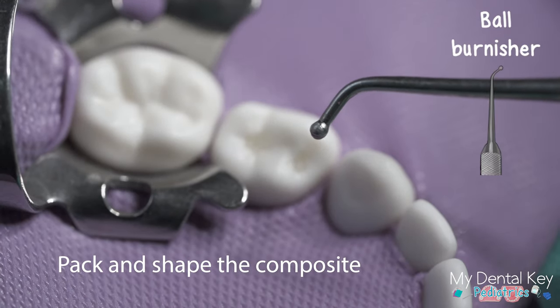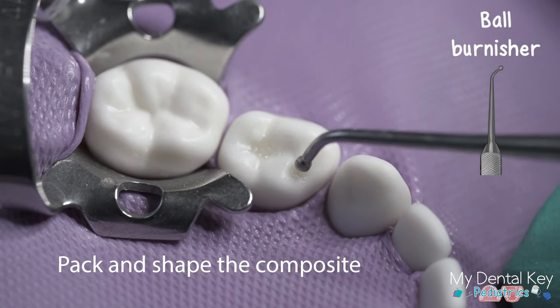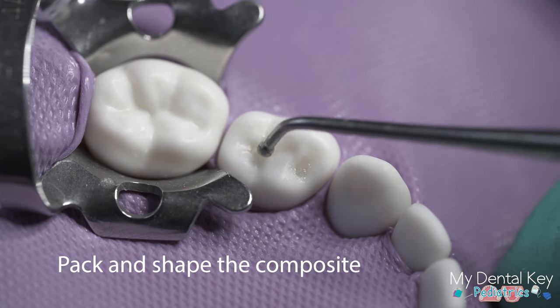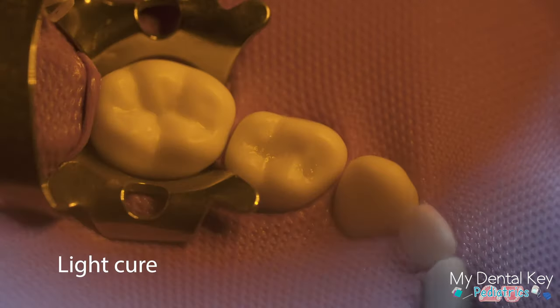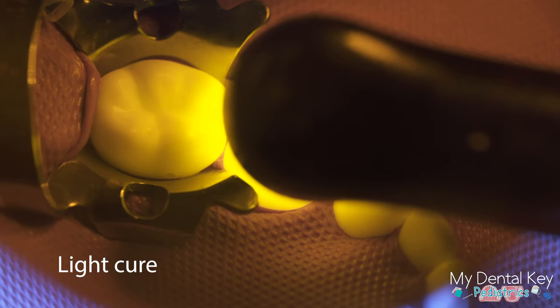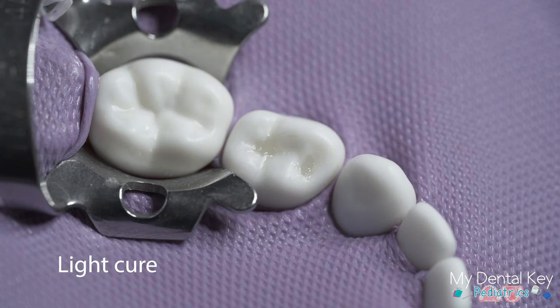You can use a variety of hand instruments to help pack and shape the composite, such as the ball instrument shown here. Use the hand instruments to create occlusal anatomy before you polymerize the composite material. Light cure the composite for 20 to 40 seconds depending on the intensity of your curing light, with the tip as close as possible but not touching the composite.